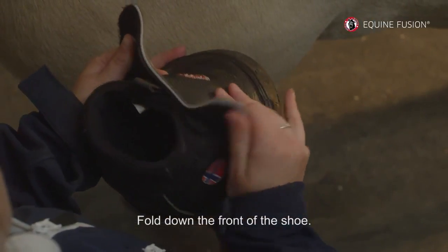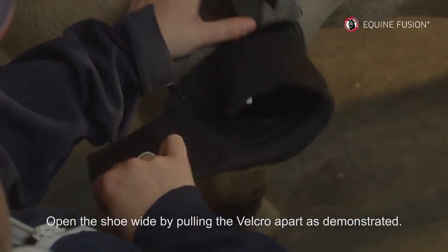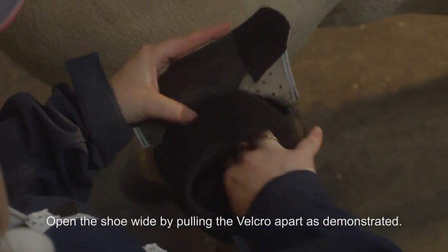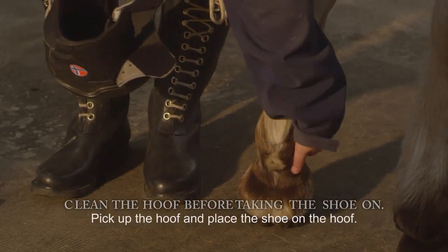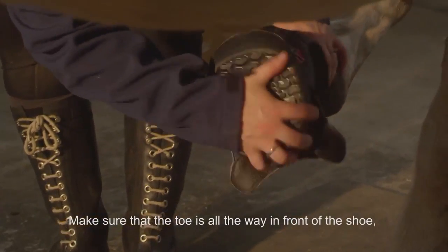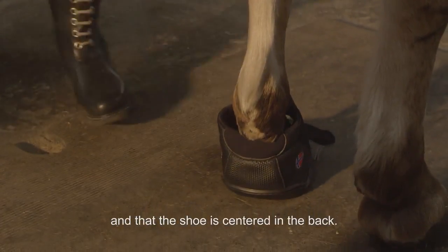Fold down the front of the shoe. Open the shoe wide by pulling the Velcro apart as demonstrated. Loosen the strap without taking it through the ring. Pick up the hoof and place the shoe on the hoof. Make sure that the toe is all the way in front of the shoe and that the shoe is centered in the back.